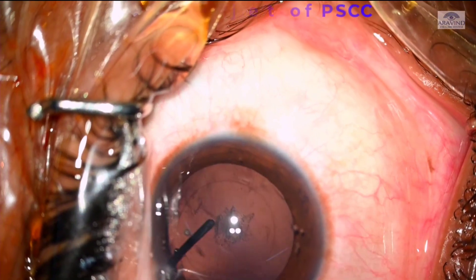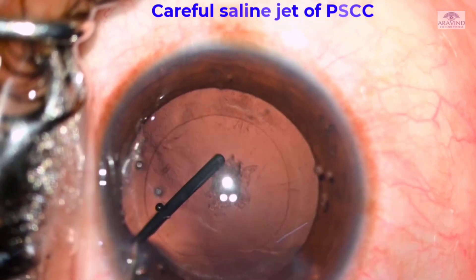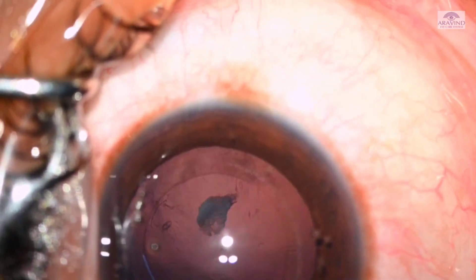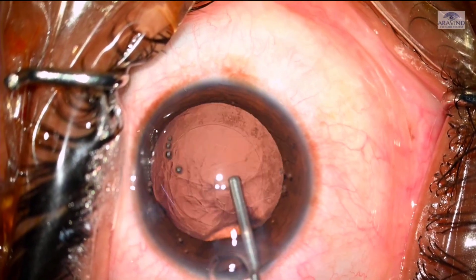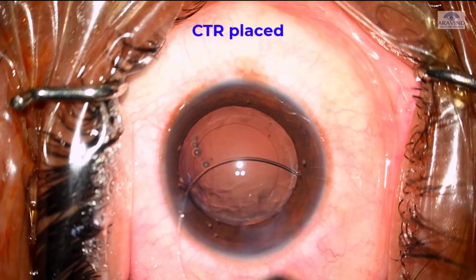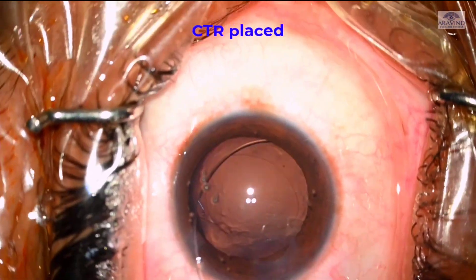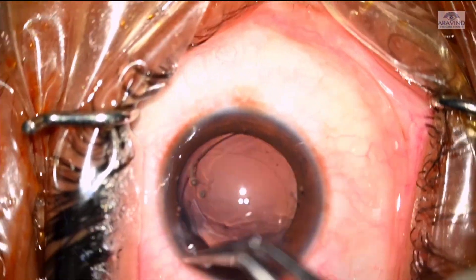Careful posterior capsular polishing is done to detach the posterior subcapsular cataract from the posterior capsule. Viscoelastic is injected and a capsular tension ring (CTR) is placed to avoid post-operative anterior capsulophimosis and decentration or subluxation of the IOL.